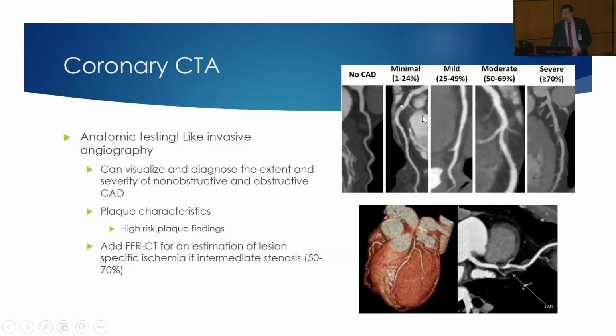And then you get into moderate stenosis, and that would be 50 to 69%. And that's an area of uncertainty. Sometimes these lesions, the intermediate ones, can be obstructive and flow limiting, and those would benefit from getting a stent. But sometimes they might not be. They might be non-obstructive. In the cath lab, we have tools that are able to delineate that.